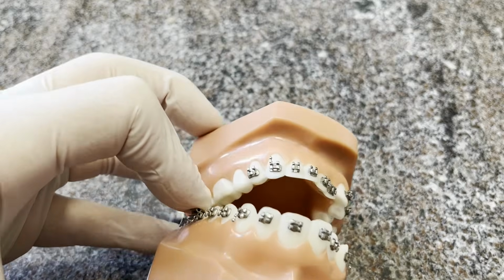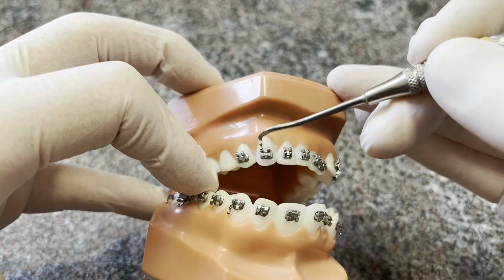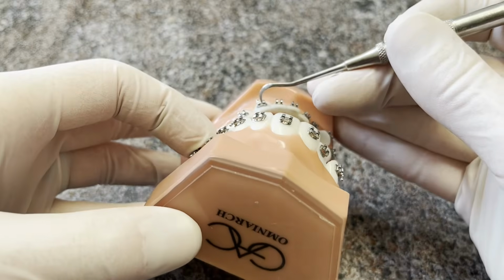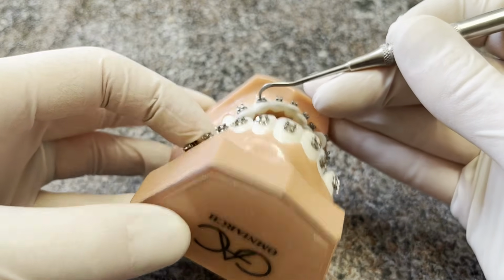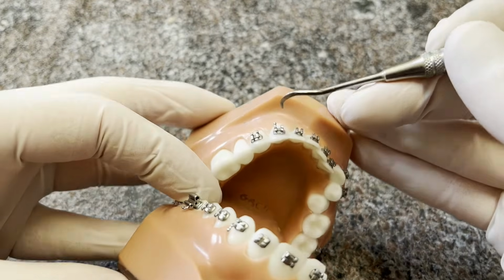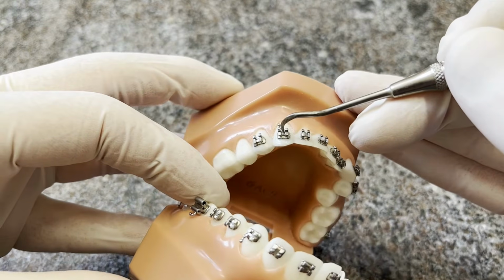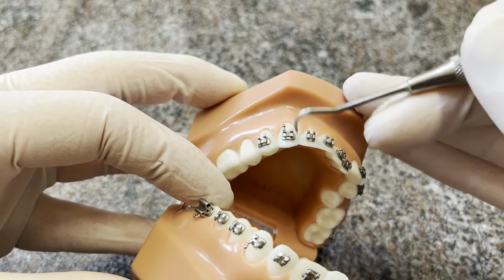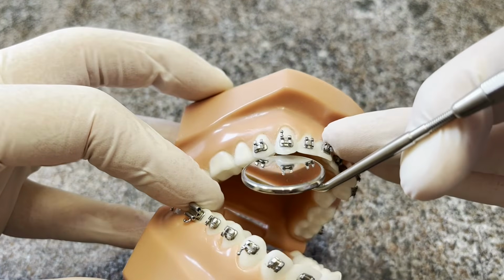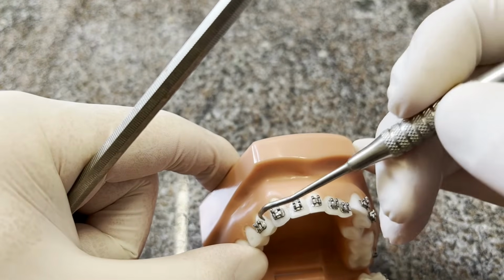The canine, you place on there. Again, you'll eyeball it, take a look at it, just have them turn and you'll look at the tooth, and you're making sure that it's parallel to the long axis of the tooth. Make sure that the center of the bracket is just to the mesial of the height of contour. And make sure that your tip is good, and then you seat it into place by pushing on the center of the bracket. Clean up your flash, and then you check from the occlusal like this, and then make sure that your tip is good by looking straight at it. Make sure it's pressed into place, all the flash is cleaned up.